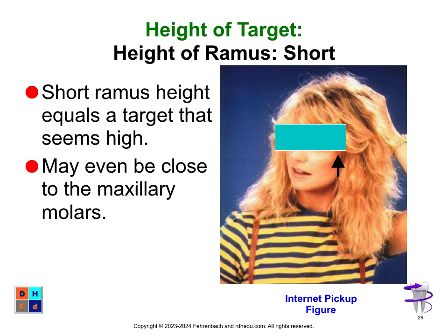In one case, I could not give an injection. I tried and tried. The maxillary molars were in my way. It's only happened once with me of all the injections I've ever given. It was a peer that I was working on. Because the student dental hygienist couldn't do it, I thought, well, let me just see if I can get close to the sweet spot.